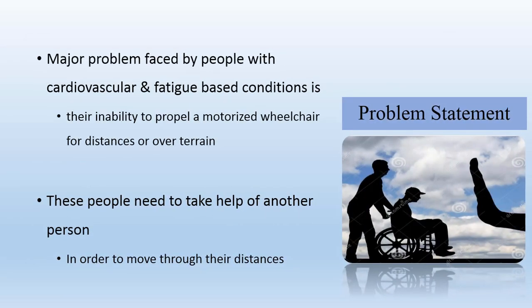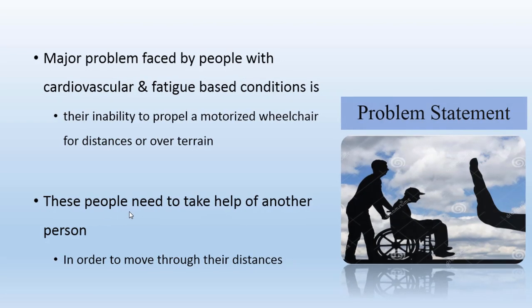The problem statement considered for this project is: we know major problem faced by people with cardiovascular and fatigue-based conditions is their inability to propel a motorized wheelchair for distances or over terrain. These people need to take help of another person in order to move through their distances.